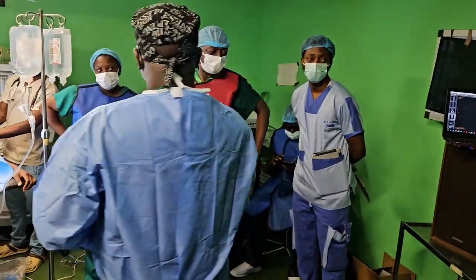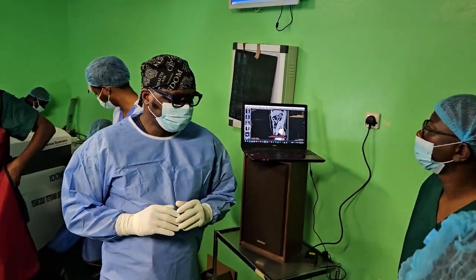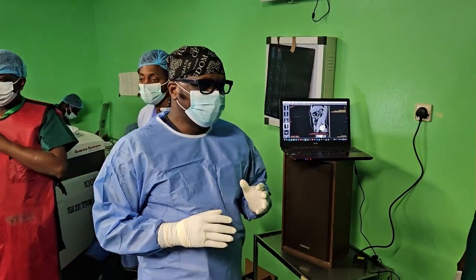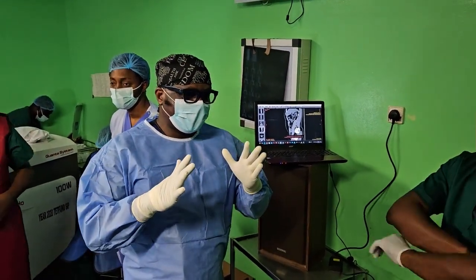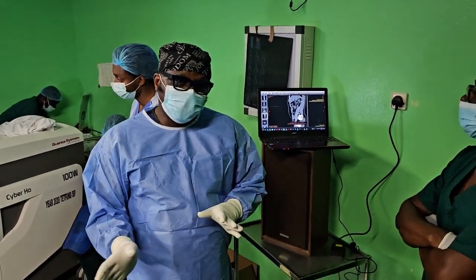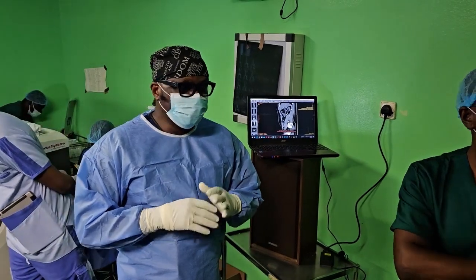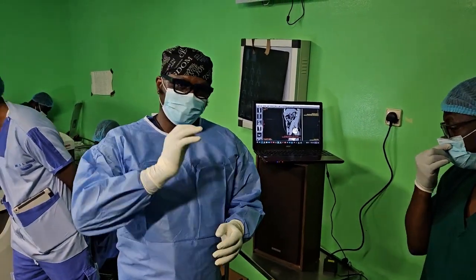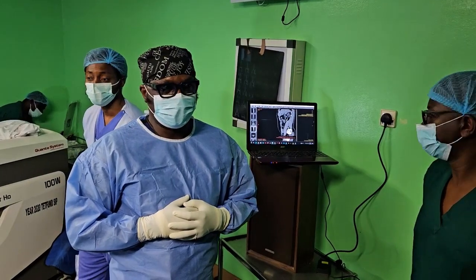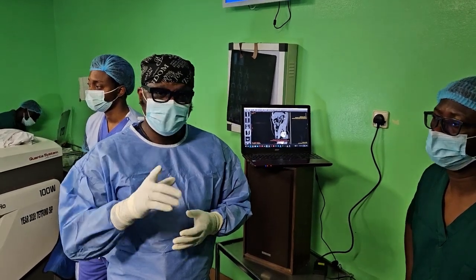Would you consider another puncture if it becomes necessary? No way, go retrograde. Is there any reason why you are avoiding a lower pole puncture? No, you see, you don't know what calyx is most appropriate until you do your RPG. It's when you position the patient prone and you do your retrograde pyelography that you know which calyx gives you the straight, short, and most direct access to the stone. Your puncture site is not cast in stone yet? It's not cast in stone until you see your RPG.